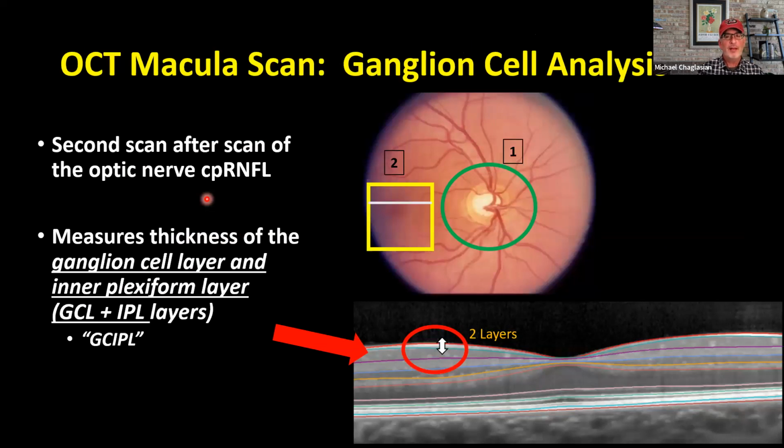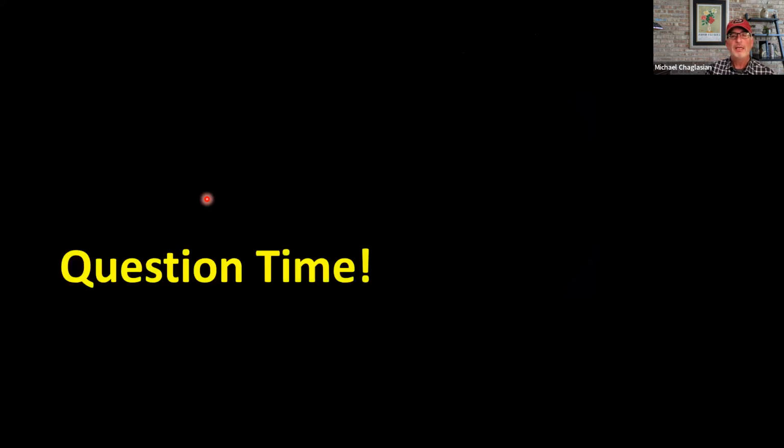For our macular scans, again, I've already highlighted that we are just taking a couple layers in the middle retina, ganglion cell and inner plexiform. So it's quite challenging. And again, you can find artifact and other disease in the macular region.